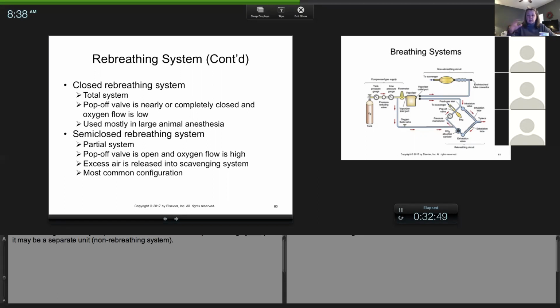Because if you close a pop-off valve, it traps your flow within the breathing system and the patient, or in the machine, the system, and the patient. And then the problem is you're delivering fresh gas, so you're going to constantly increase the pressure. That's why one anesthetic death that can happen is if you leave the pop-off closed, and it can blow up the lungs or it can stop the heart. So the pop-off valve, it's very critical.